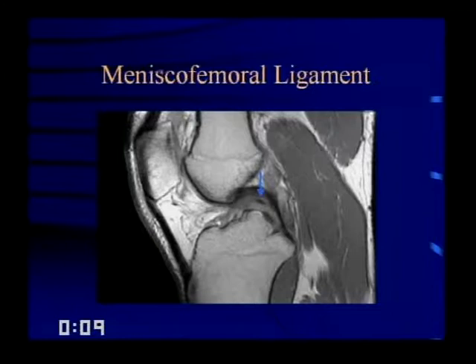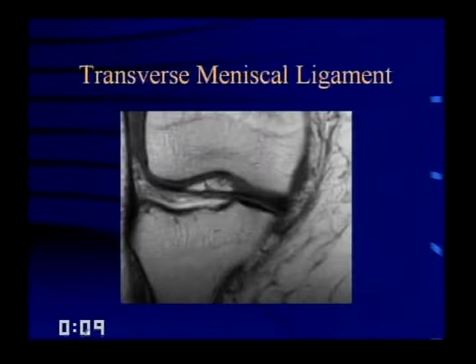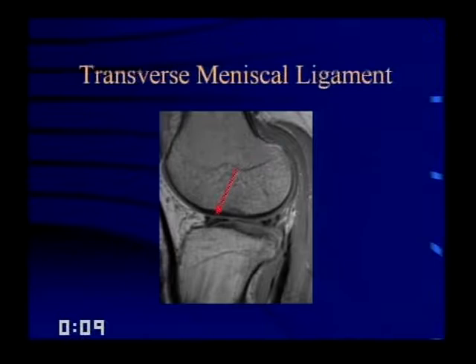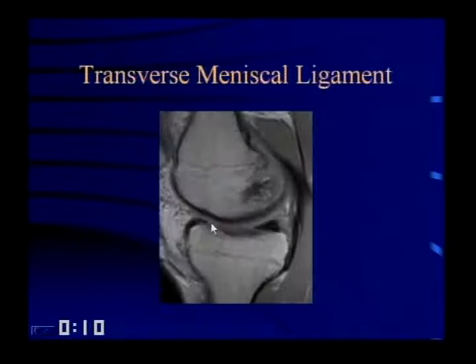The transverse meniscal ligament attaches the anterior horns of the lateral and medial meniscus in about 40% of patients. Its attachment to the anterior horn of the lateral meniscus may simulate a tear — rarely a problem on the medial side. Here's a nice example: this person does have a longitudinal tear, but there's also something at the anterior horn that might look like a tear. Following that little dot, you see it's really just the transverse meniscal ligament inserting into the anterior horn of the medial meniscus.